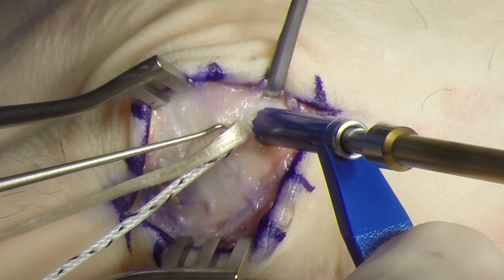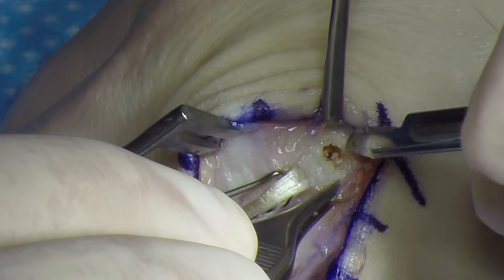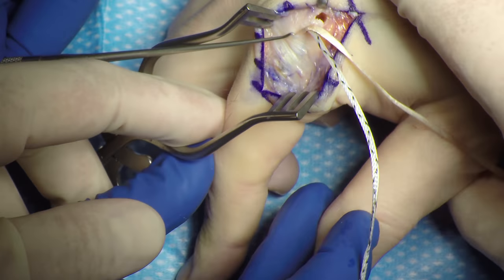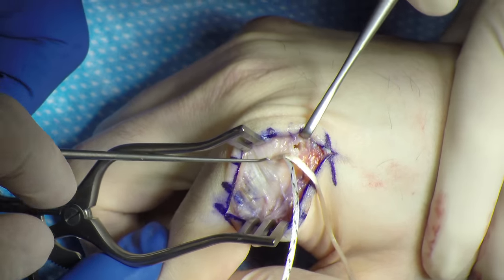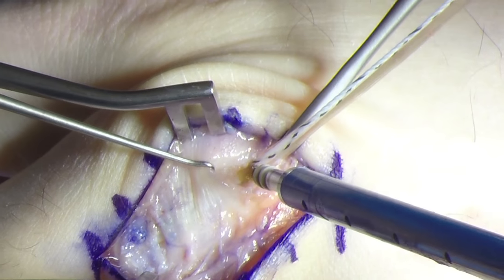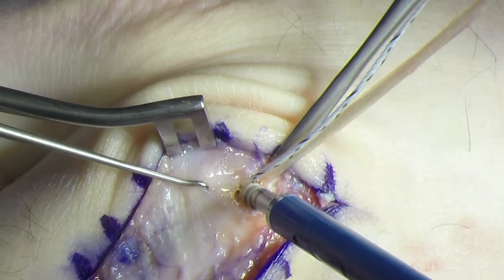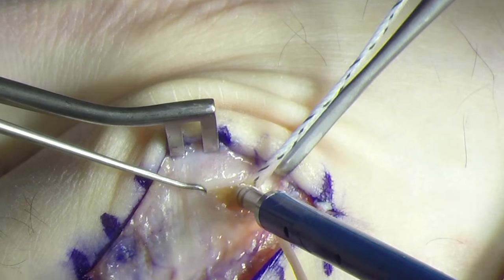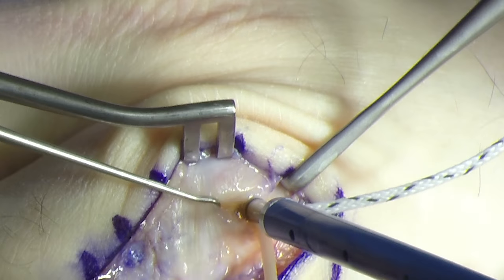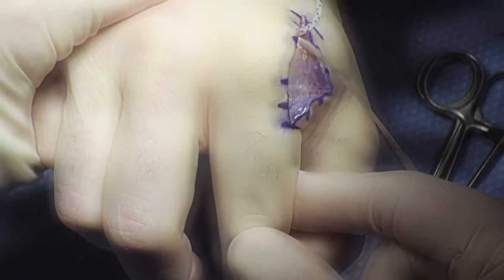A 3.5 mm tunnel is drilled and the soft tissues surrounding the tunnel are cleared. The MP joint is placed in 60 degrees of flexion with neutral adduction-abduction. The anchor is inserted — it's very important to make sure that every strand of the graft is within the fork or the inserter will not pass easily. The same slow, firm pressure is used to get the anchor to deploy appropriately. The joint is then placed through a range of motion and stability is confirmed.